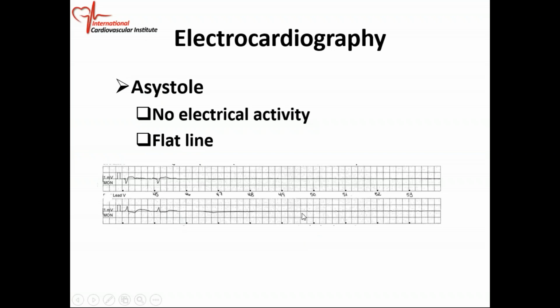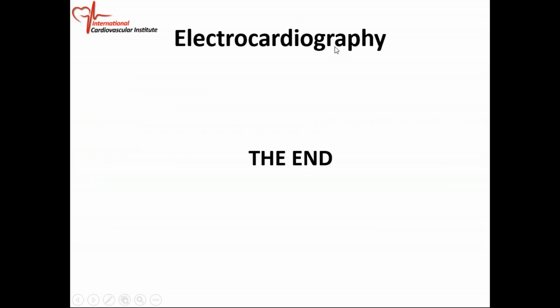But anyway, when someone is asystolic, it continues forever, and the heart stands still. If the heart stands still, you're going to be dead. So it's flatline. So that concludes our ECG session.